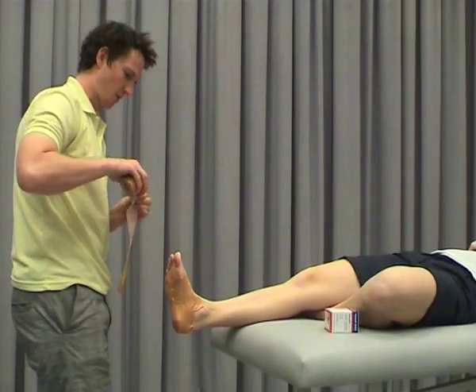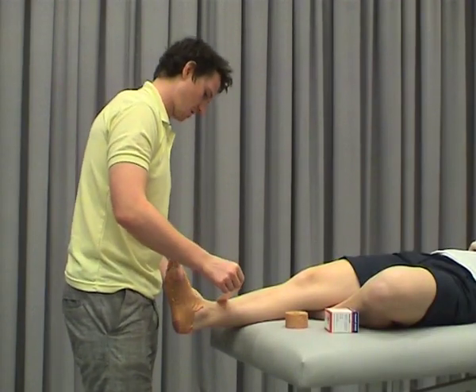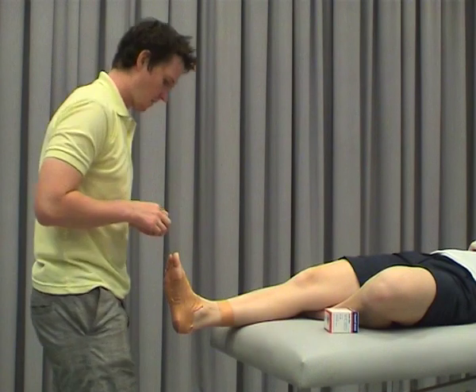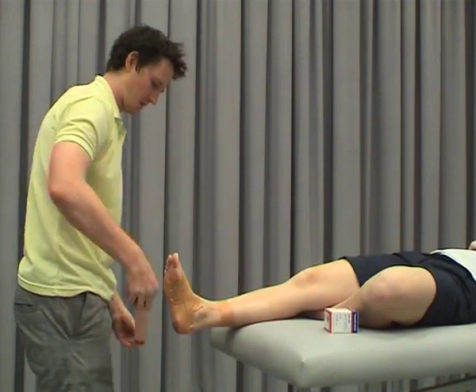It's really important that the person holds their foot in dorsiflexion during this, because everyone wants to relax their calf. So we'll just start with our anchor here. Now what we're going to do is some sixes — we'll just size up our tape first.